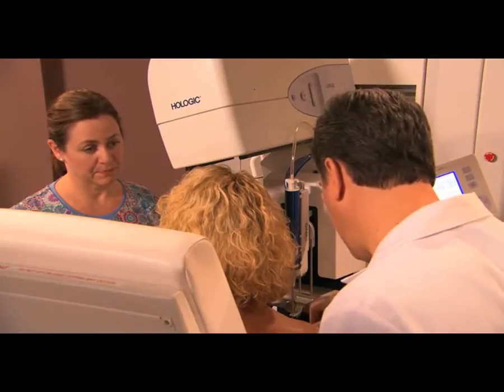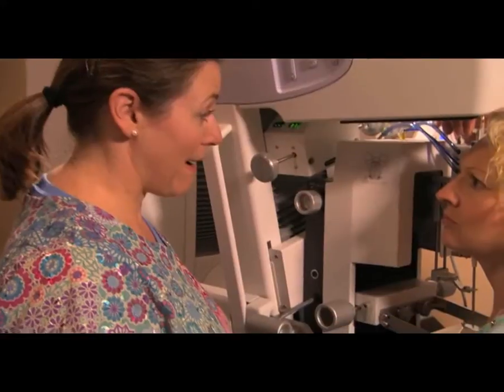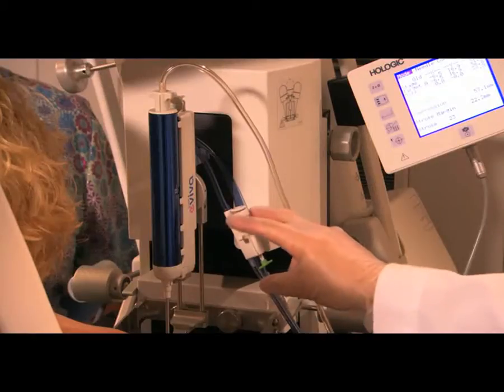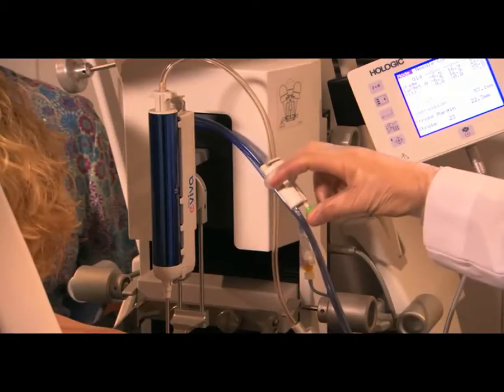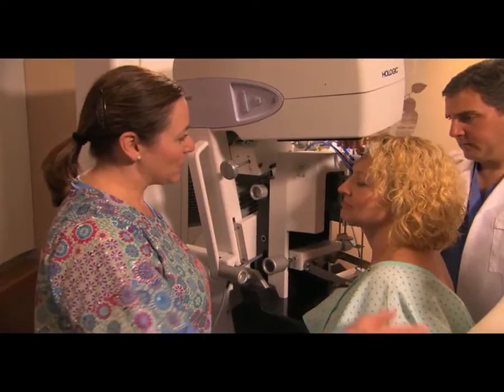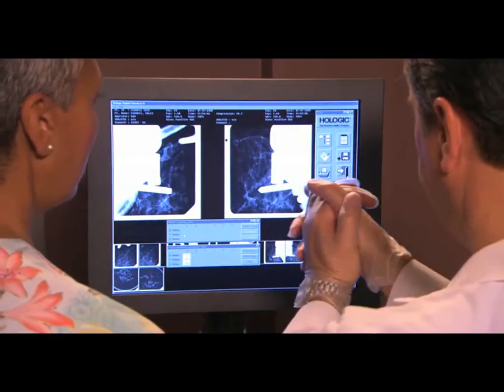Next, they will clean and numb your breast prior to making a small incision. This is the time when it's important to hold very still. Because when the instrument is triggered, you'll hear a noise and you may feel some pressure. This advances the tip of the needle into your tissue to the exact point where they want to take a sample.